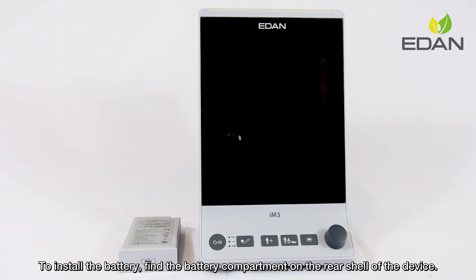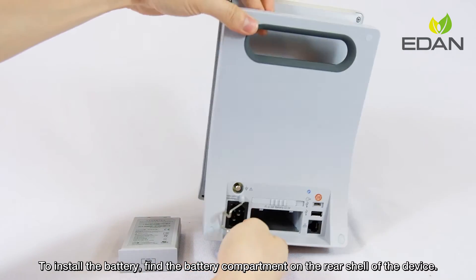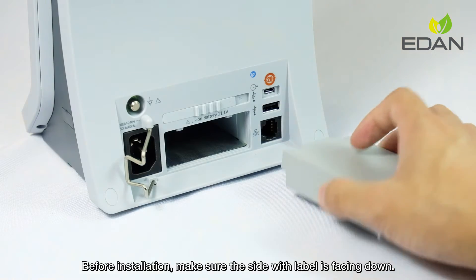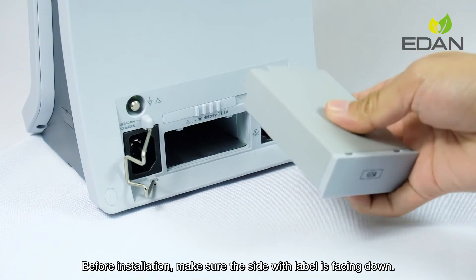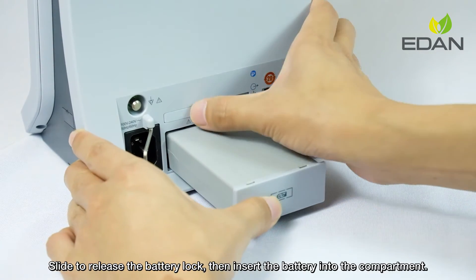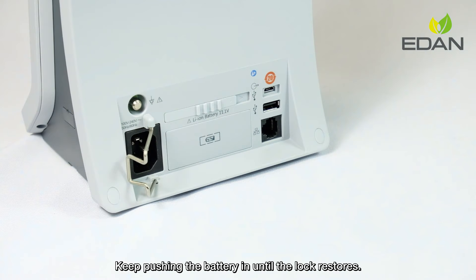To install the battery, find the battery compartment on the rear side of the device. Before installation, make sure the side with the label is facing down. Slide to release the battery lock, then insert the battery into the compartment. Keep pushing the battery in until the lock restores.